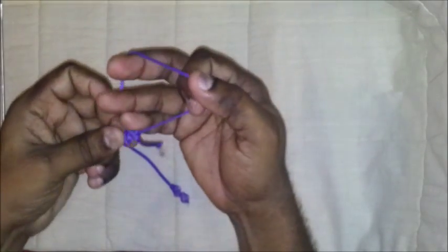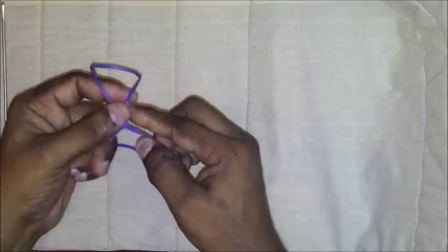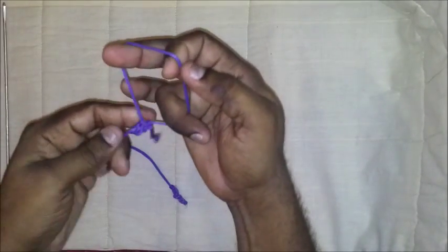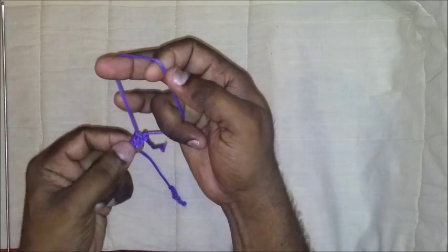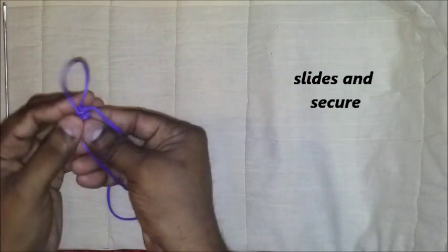Now this knot is ready. This knot is now ready to be assembled over the knot pusher and it slides easily. It is secure.